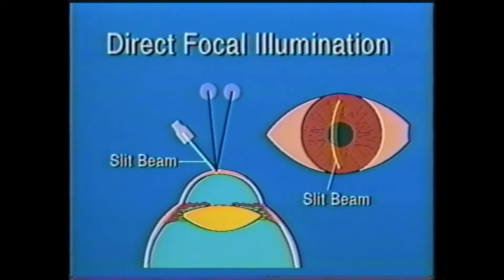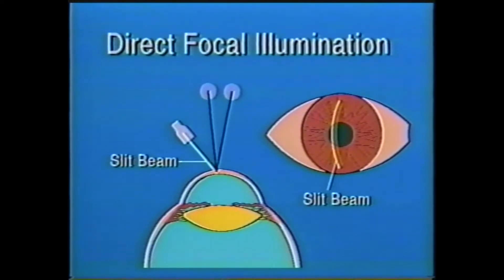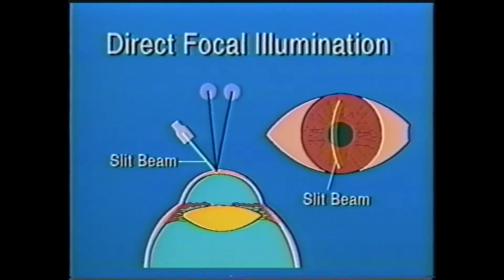Two, direct or focal illumination. This makes use of the hairline slit beam. The microscope and slit beam are directly in focus on the object being examined. This is particularly suited to depth localization and shows that this corneal abrasion is very superficial.